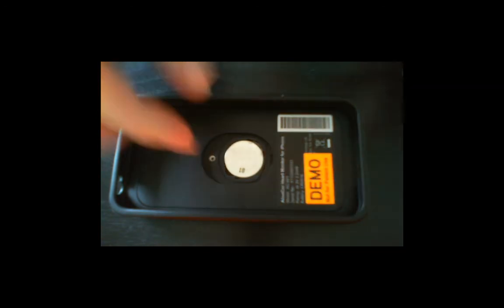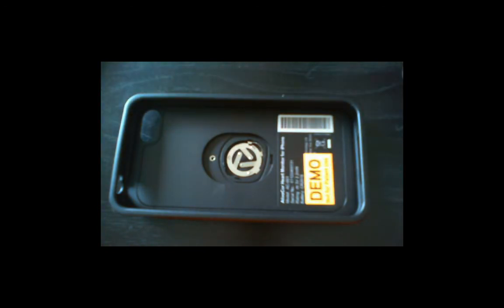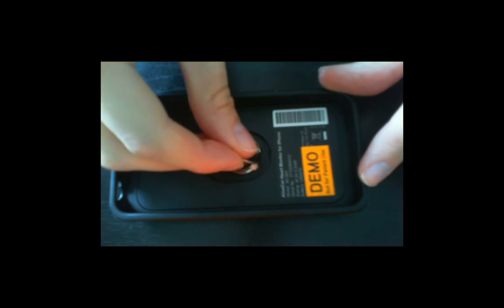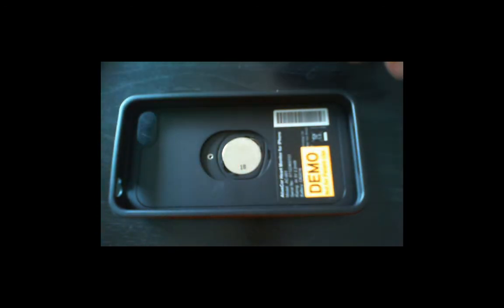Remove the old battery and replace it with a new 3-volt button cell battery. Make sure the writing on the battery is facing up and snap it into place.